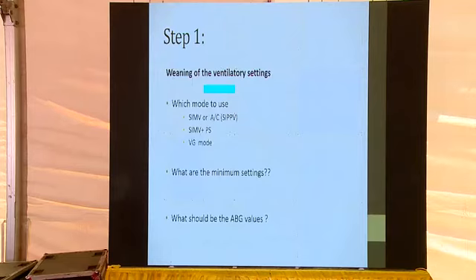But the problem is, if the patient is, let's say, a 26 to 28 weeker, hardly breathing, or has decided to go into apnea and breathe only once in 30 to 40 breaths, the tidal volume and minute ventilation you achieve is not decided by you, inspiratory time is not decided by you, expiratory time is not decided by you, correct? Basically, assist control without the inspiratory time is pressure support.